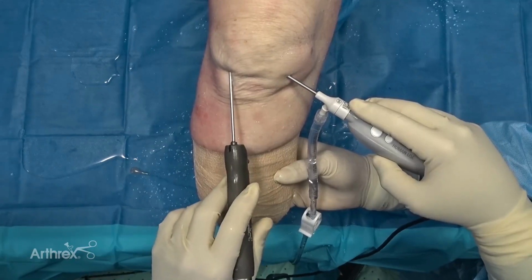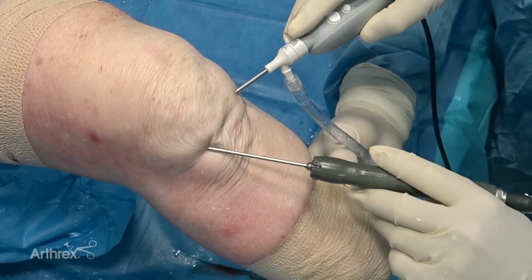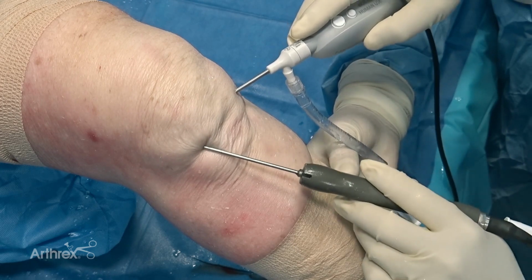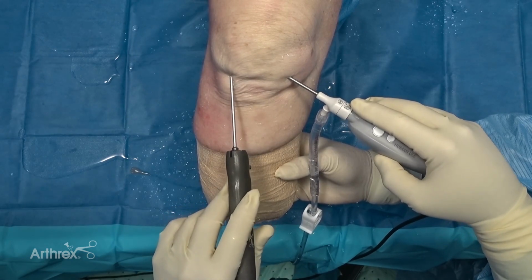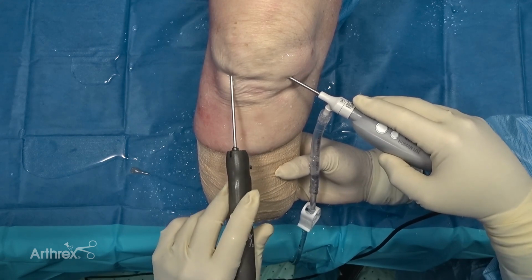Now I'm on the lateral side of the trochlea. I'm still harvesting the autograft cartilage cells with the GraftNet. I would say this is more like a dental procedure. I can hold the Nanosaber like a pen, and that dramatically affects your preciseness in the joint. Also, over a long day of operating, it's going to fatigue you less. I think it balances so greatly, as you can see with my other hand, which has the nanoscope.